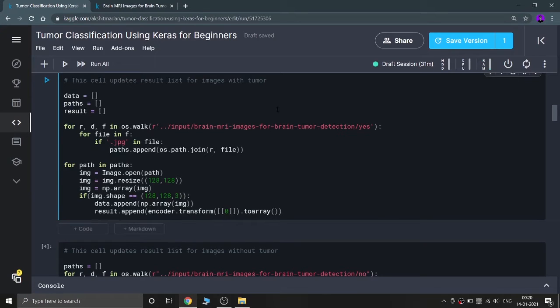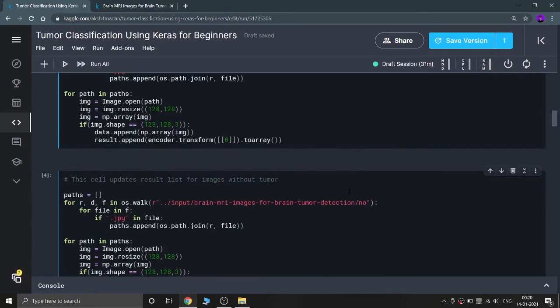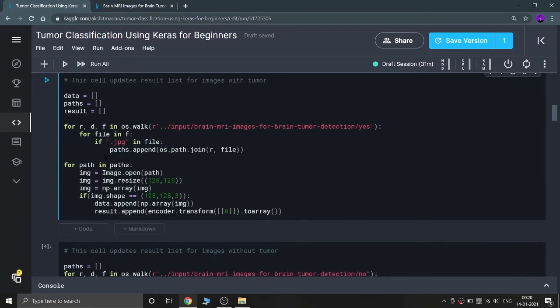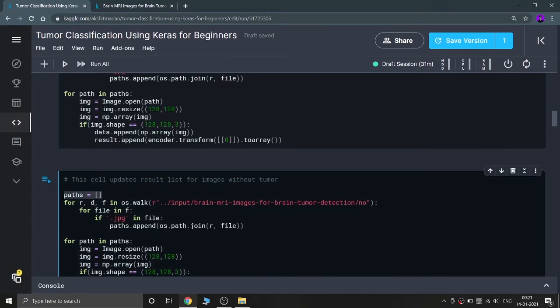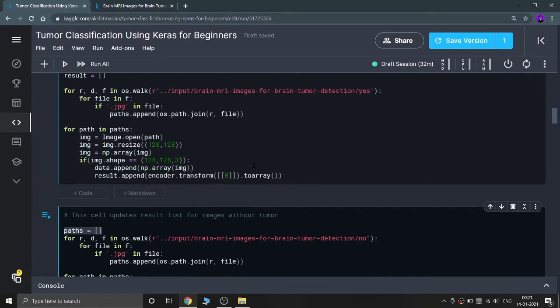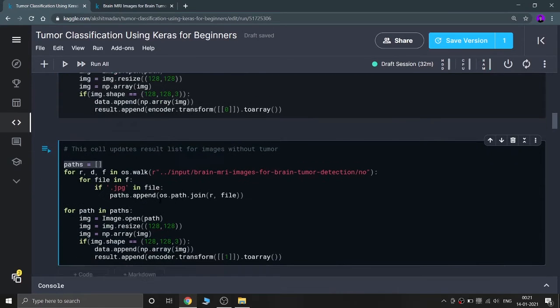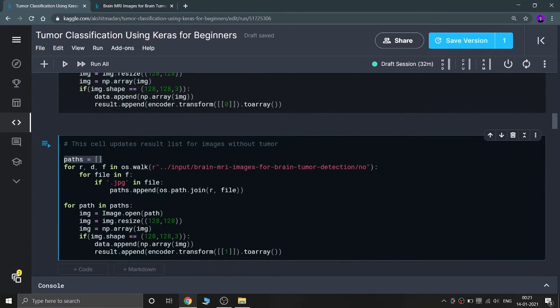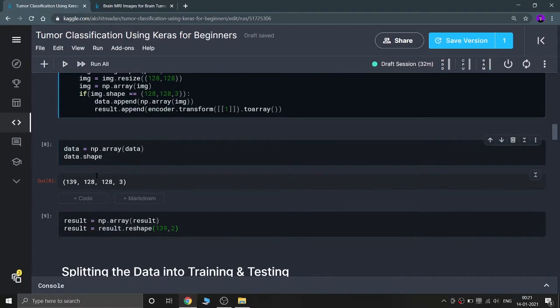After processing the 'yes' folder, I do the same thing for the 'no' folder — resetting the paths list to an empty list, then walking through and appending data and result. The data and result lists accumulate images from both folders. Finally, I convert data and result into numpy form, since my model expects numpy arrays.